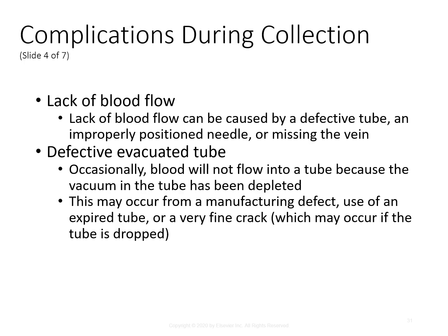Always take extra tubes to the bedside or the outpatient area just in case something like this does happen. You don't want to have the needle in the arm and not have your supplies ready, and not be able to reach the extra tube that you need. So just make sure you have some extras that you can reach. And if you find a defective tube, be sure to note the expiration date and lot number, because it could be more than just that one tube, right? It could be the whole box of tubes that we just got in that could be the issue. So we need to make sure we document these things as well.